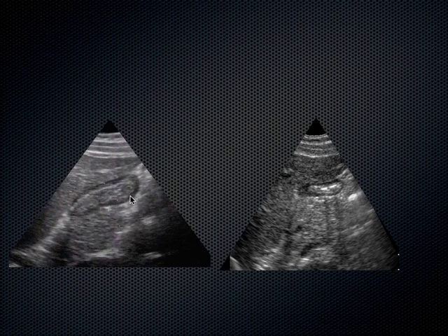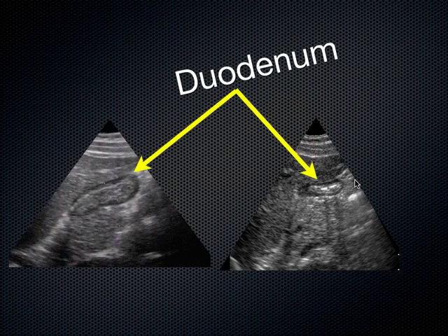It's got this hypoechoic wall to it. So this is a loop of intestine. Specifically, it's the duodenum. We can see the duodenum sometimes during mid-peristalsis when it's sort of contracted down on itself. And when there's air in the duodenum casting shadows, and that duodenum is right next to the gallbladder, it's easy to mistake a normal duodenum for having gallstones, for looking like a WES sign sometimes.